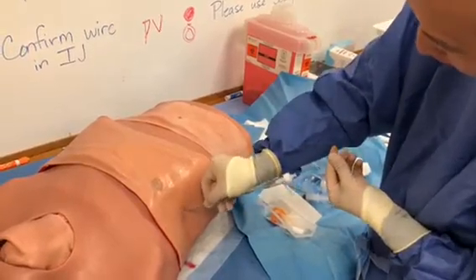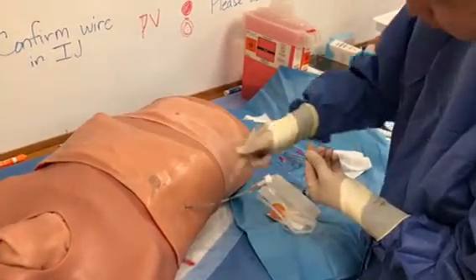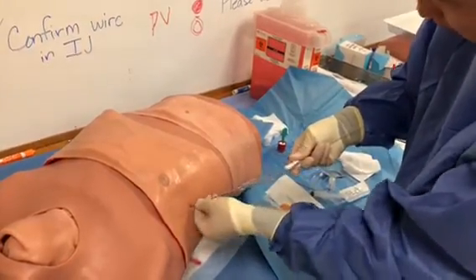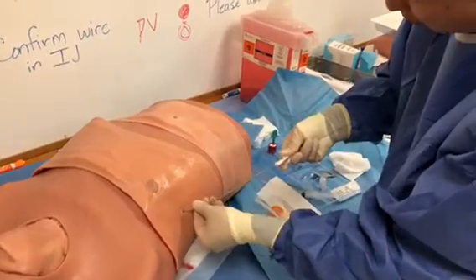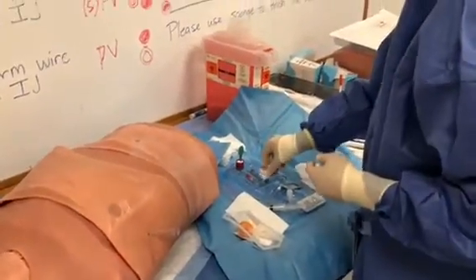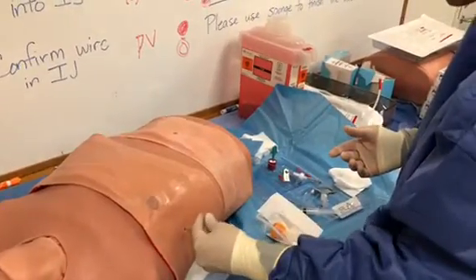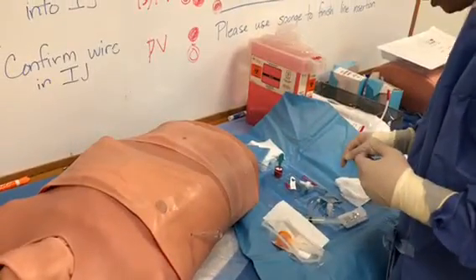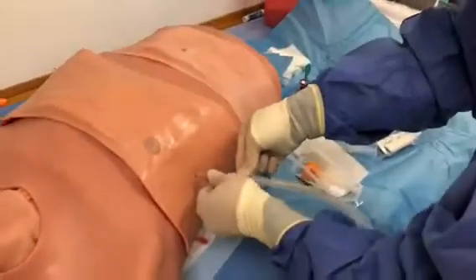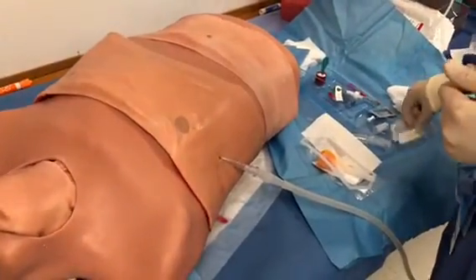Thread over the wire into the pleural space. At this point you should be in the pleural space, so you don't have to place the entire catheter. Slide the dilator out and feed the tube into the pleural space, then take everything out. You're essentially done. You may want to hold and cover it briefly if the patient has pneumothorax or effusion, so fluid doesn't spill. Then plug it in and you're almost done.